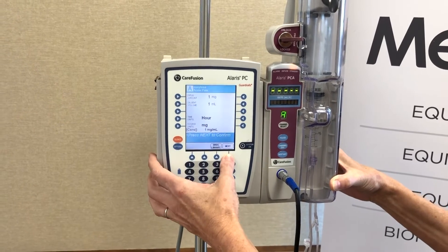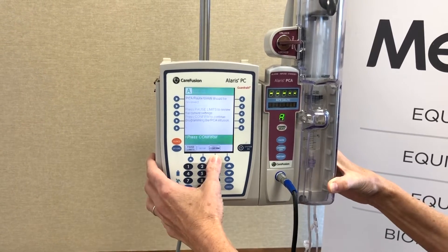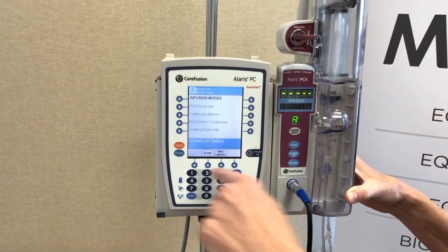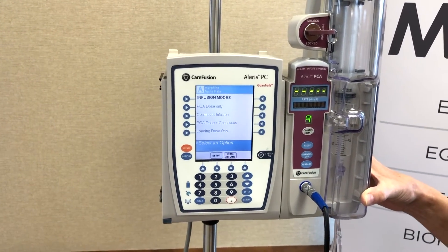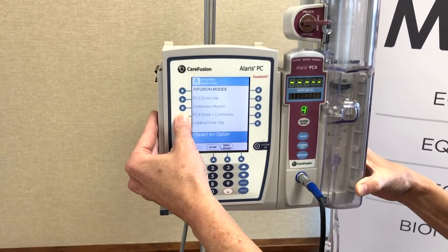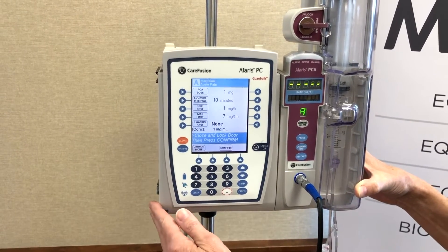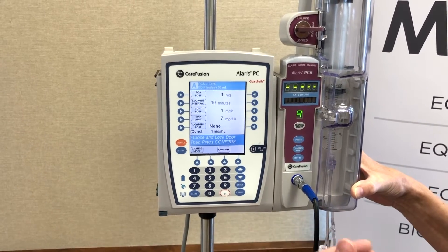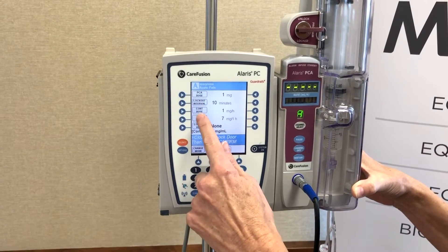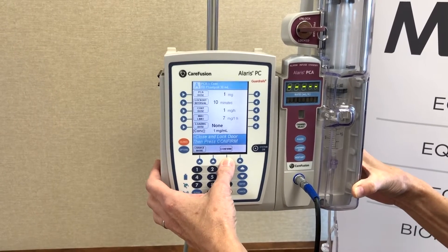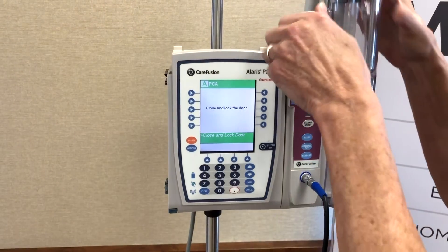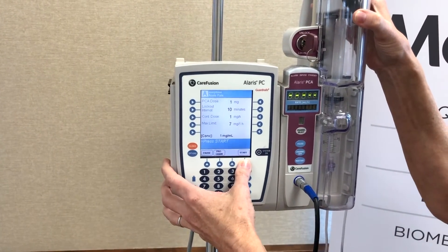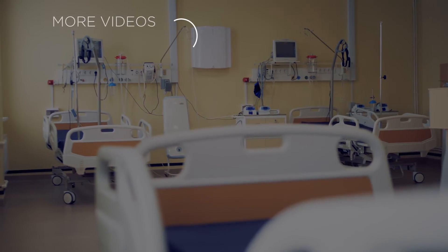Now I'm just going to verify one-to-one and confirm that. Here are my infusion modes — your multiple ways to infuse your PCA meds. I'm going to choose PCA dose plus continuous. This is pre-populated based on physician orders. If it were not, you would be able to program each one of these steps to follow a doctor's order. Now it's telling me to close and lock the door. And now I can press start. Watch your pump right up. So that's it.